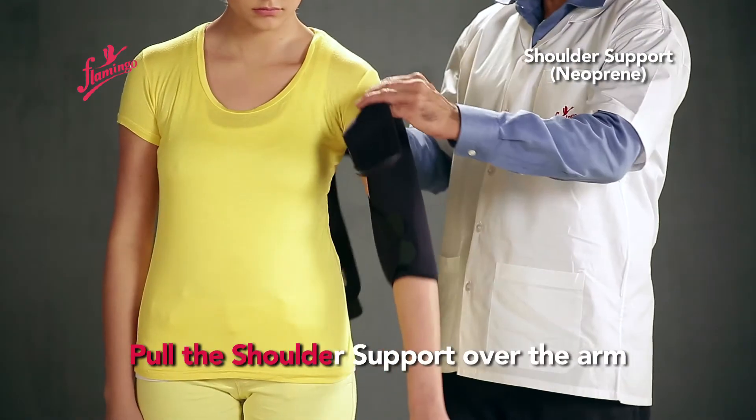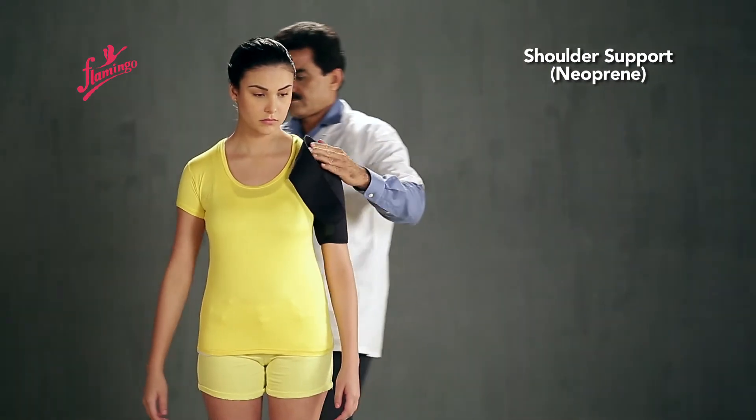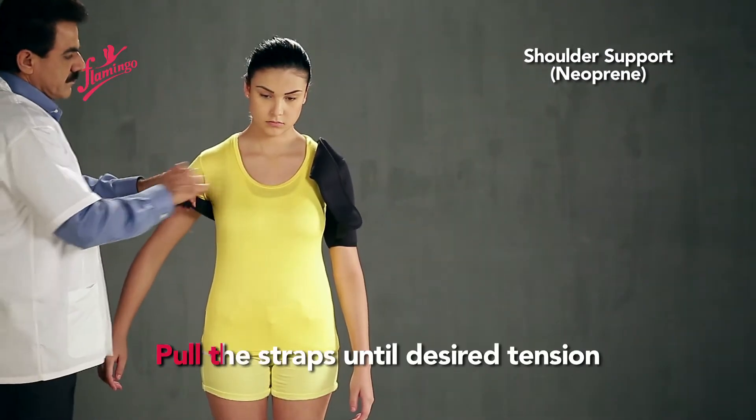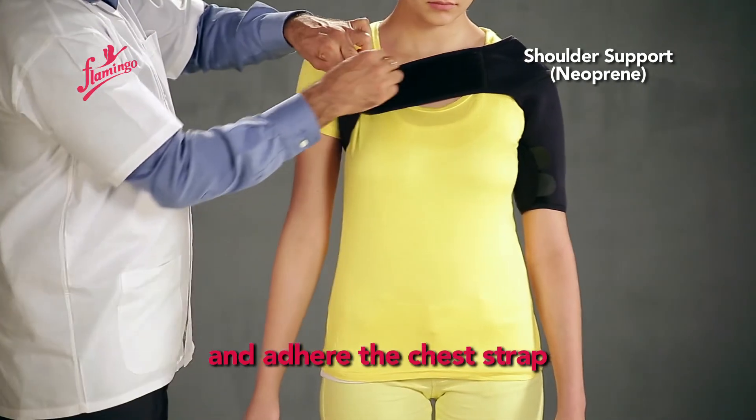Pull the shoulder support over the arm and shoulder. Pull the straps until desired tension and adhere the chest strap.